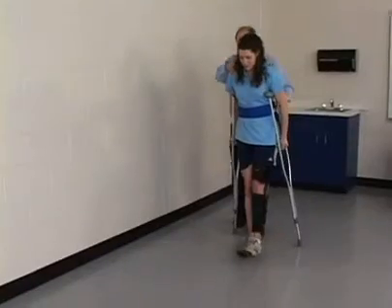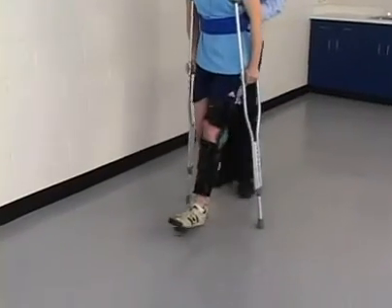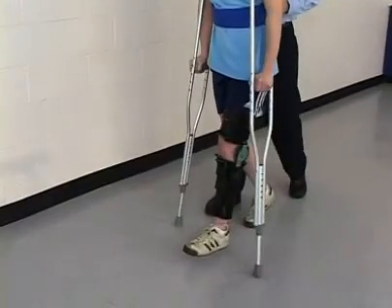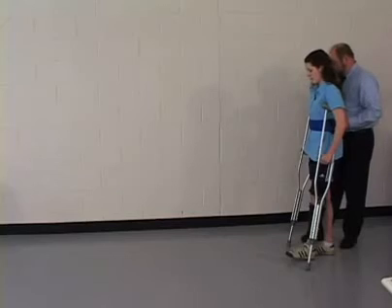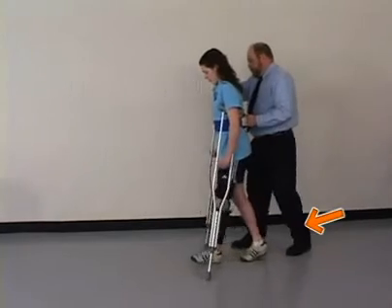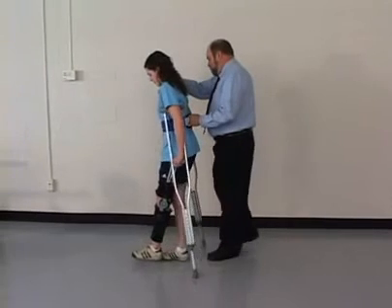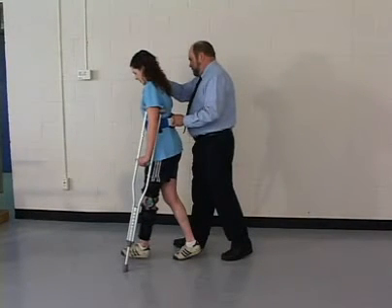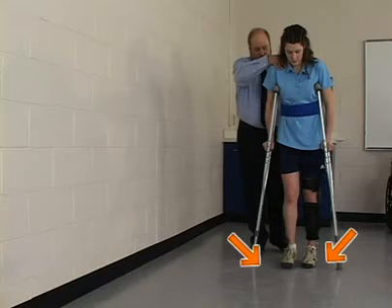Using her upper extremities to support her body weight, the patient advances her uninvolved lower extremity beyond the crutches. Initially, the patient may step to her involved lower extremity rather than step through. Stepping through is the normal gait pattern, and the therapist should encourage it. Again, the therapist advances his left or inside foot as the patient moves her uninvolved lower extremity. This sequence is repeated.